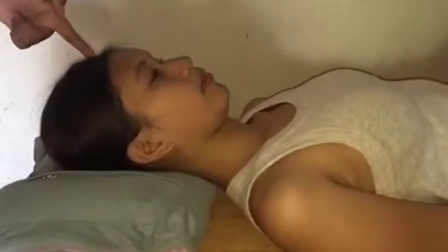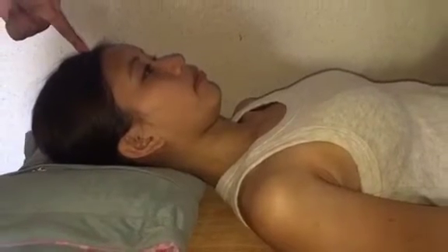So position description: the patient is in the supine position, with the OML and IOML and MSP perpendicular to the IR. And the central ray entrance is 2.5 to 3 inches above glabella, 30-degree caudal, 37 caudad.